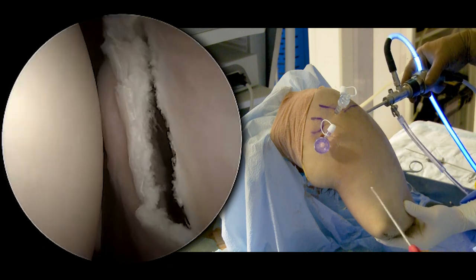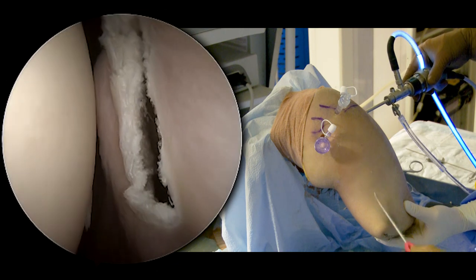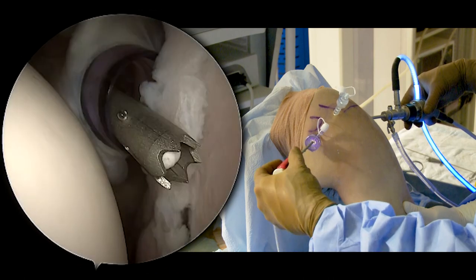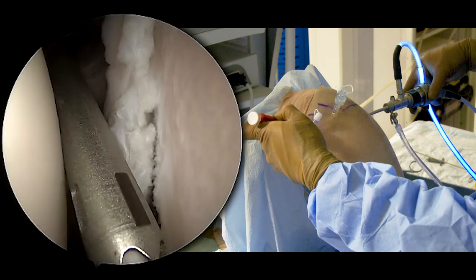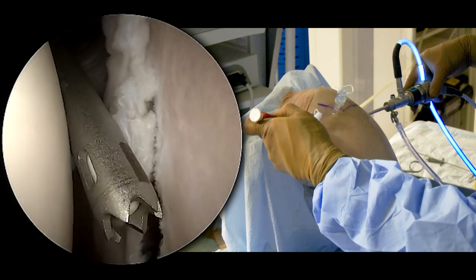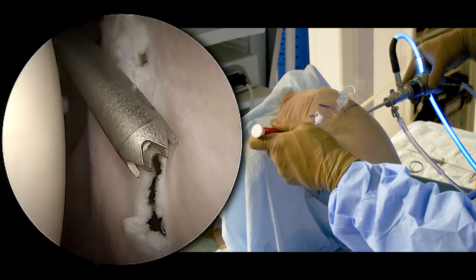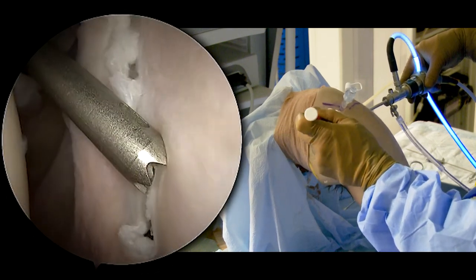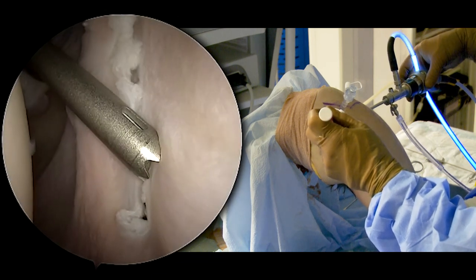Our first anchor is going to go down low. This Bankart goes down to about the seven o'clock position or so. I'm going to come in with this curved guide — this is a 15 degree curve, which really allows us to get down low. You can see the mark there, which demonstrates where the concave side of the guide is. It has nice sharp points on it, which allows you to really get a good bite on the glenoid face, and then we can put the anchor right where we desire.